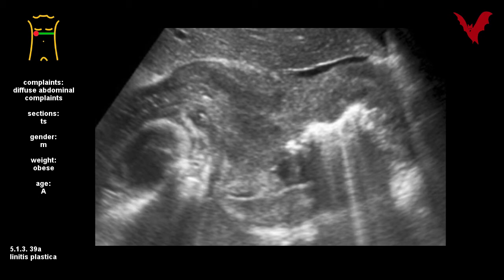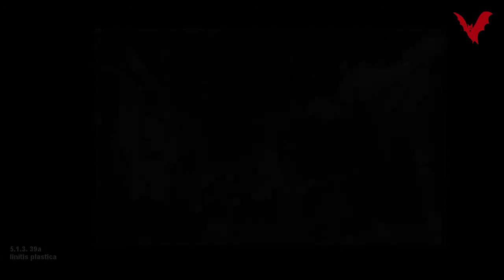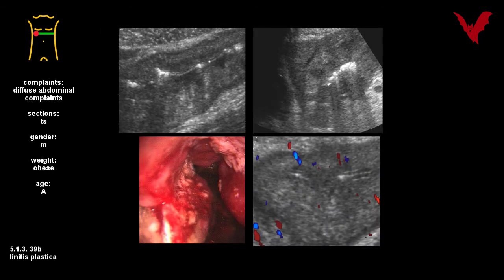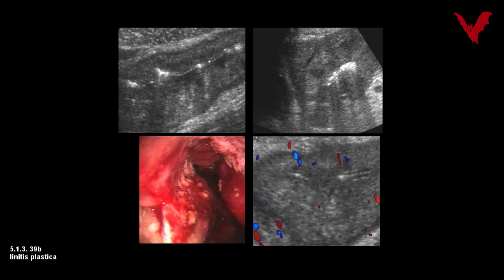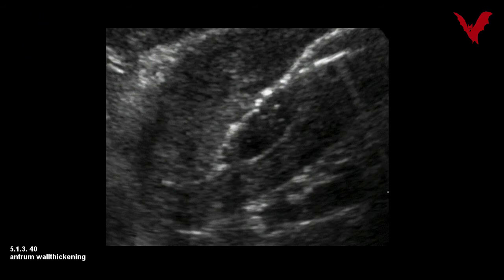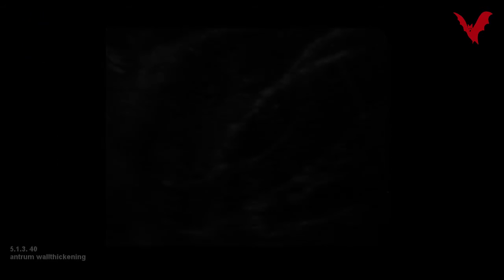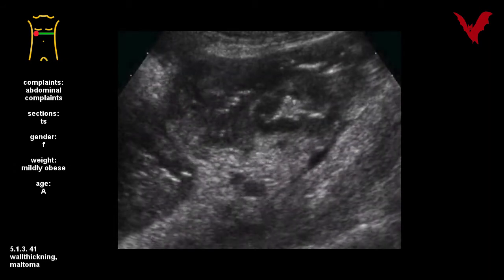Unlike the two different cases in 39a and 39b, with wall thickening, wall stiffness, and the loss of layers, in case 40 these stigmata are limited to the gastric antrum alone. In case 41, however, this is the pathology of a generalized condition.